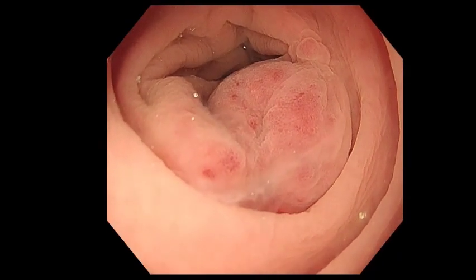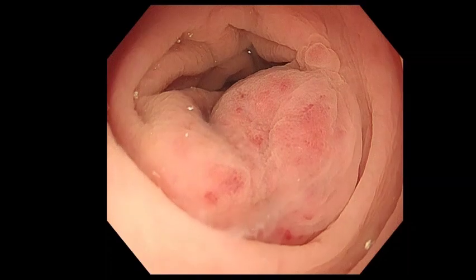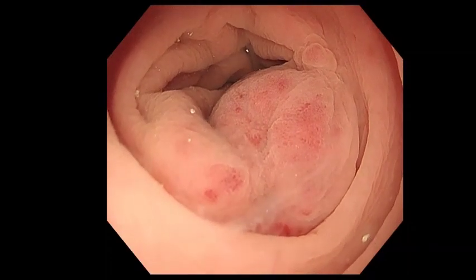We used a sliding tube, STCB1 Olympus, which was a splint device preloaded over the scope for preventing the loop formation of the sigmoid colon. A forward-oblique viewing radial echo endoscope, GF-UE290 Olympus, was successfully passed through the lumen of the tube to the descending colon.